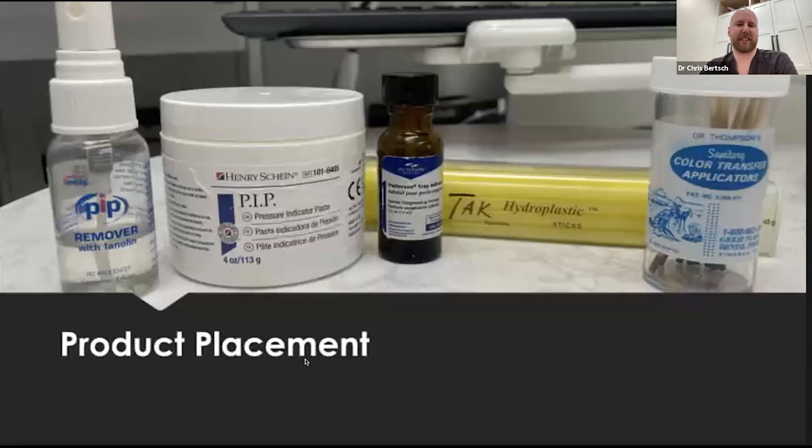I call this my product placement slide, because we have tubs made with denture adjustment stuff, and this is my go-to PIP paste. I could eat it. We buy it in the big tubs because I use it on every denture. Every time a patient comes in with a sore spot, their denture is not fitting right, I use PIP paste. Every delivery, before we let the patient go, I check it with PIP paste, because even though it might feel good right away, there can be an area that's going to be rubbing, that's burnt through. I adjust that, check with PIP paste again, and then let the patient go. That's how I cut back on adjustments and patients needing to come back: check with PIP before they leave at every delivery, and then we're good to go.